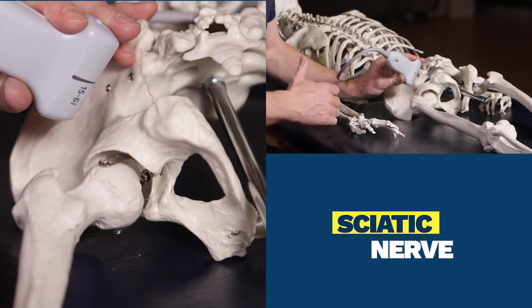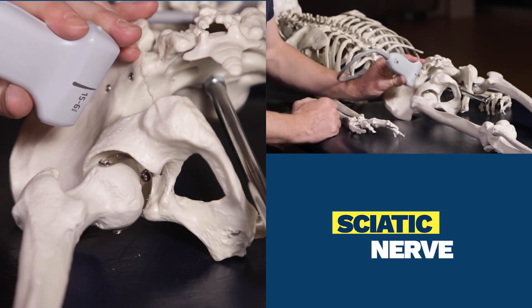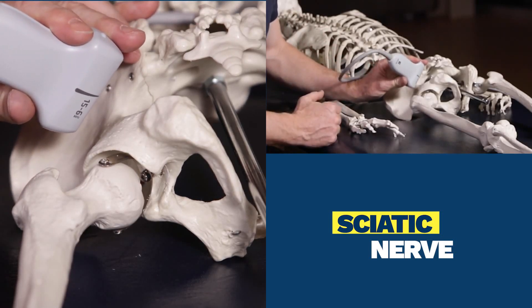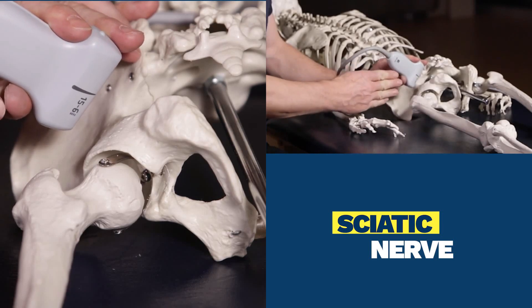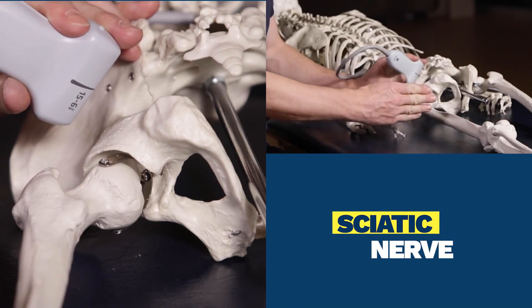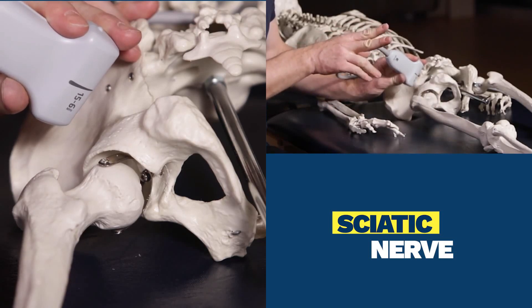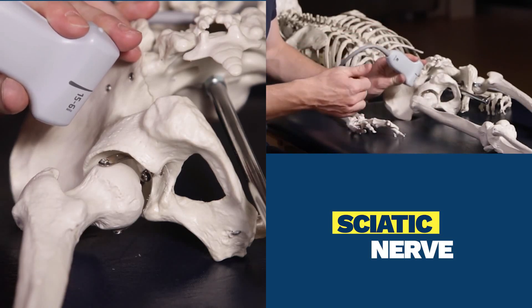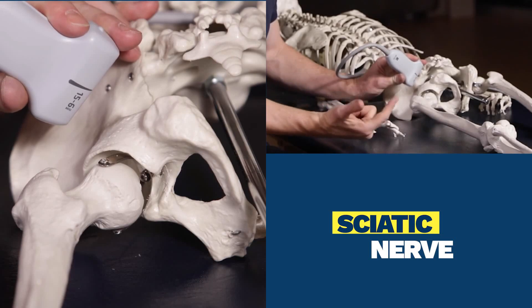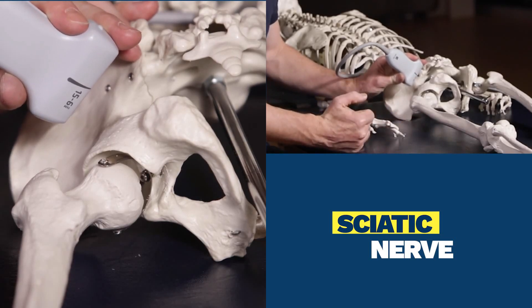Through here you can see the piriformis, and if we slide just a little bit distal you can see the sciatic nerve emerge. We can then trace the sciatic nerve from here all the way down the femur until it bifurcates, becoming the tibial nerve and the common fibular nerve, previously known as the common peroneal nerve.